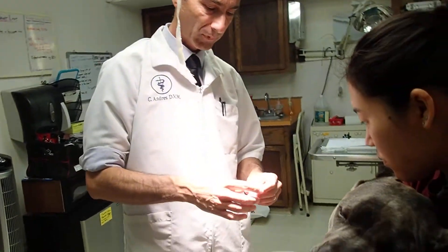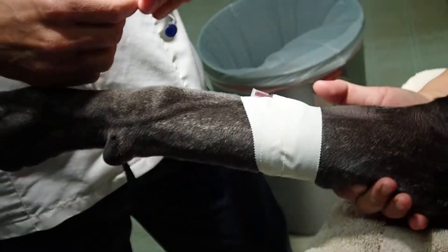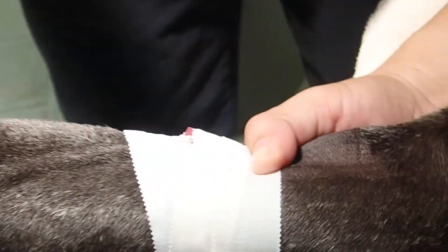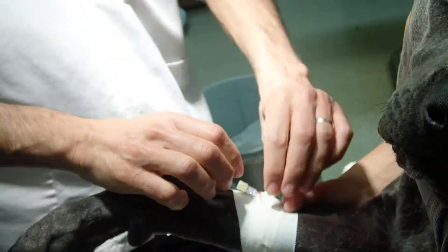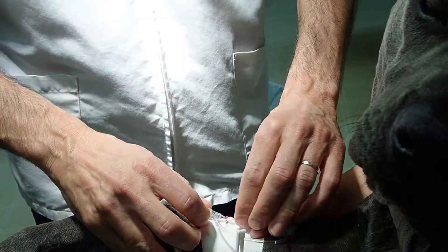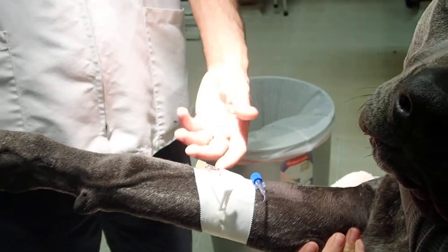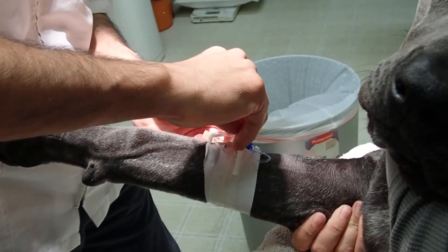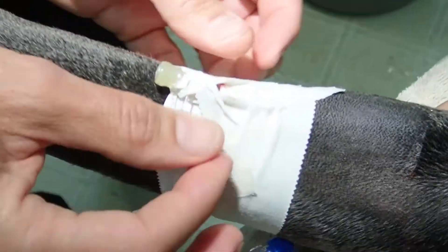We'll take our T-port — I like to put the pinch clamp right in the middle. I've already pre-flushed it with saline. Now I'm going to have Madison hold off the vein again so that blood doesn't start to flow out. I can remove the filter cap, take the cap off the T-port, and put the T-port in. I want to orient the T-port medially — I'll show you why in a minute. So now I'm going to use this little bow tie piece of tape, which is what's going to hold onto the T-port. You just cross that over, so the twisted part sits right over the T-port — the actual T.